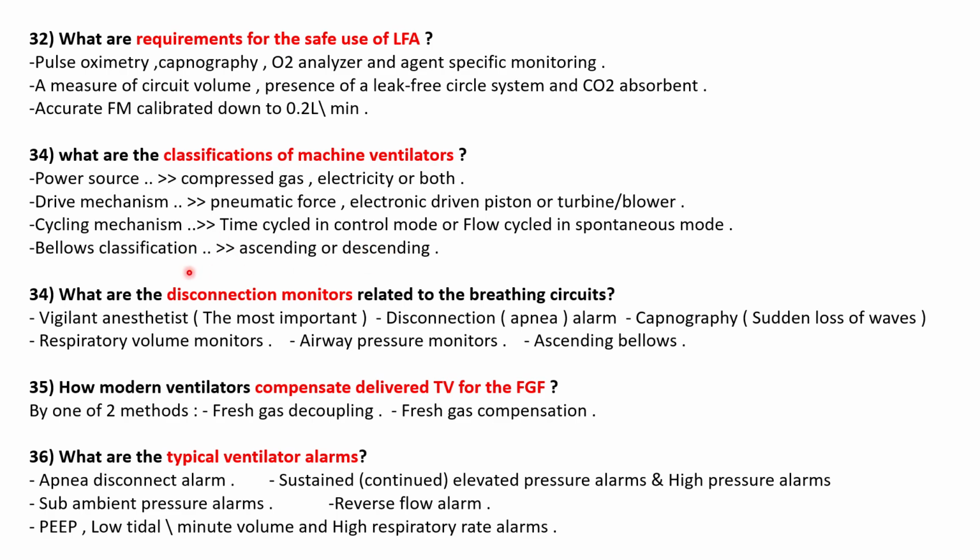This is another question. Okay, what are the disconnection monitors related to breathing systems? The vigilant anesthetist is the most important. Monitoring for any operation theater conducting any type of anesthesia, general, regional, or even monitored anesthesia care. Okay, disconnection or apnea alarm, capnograph, sudden loss of waves, respiratory volume monitors, airway pressure monitors, ascending bellows.